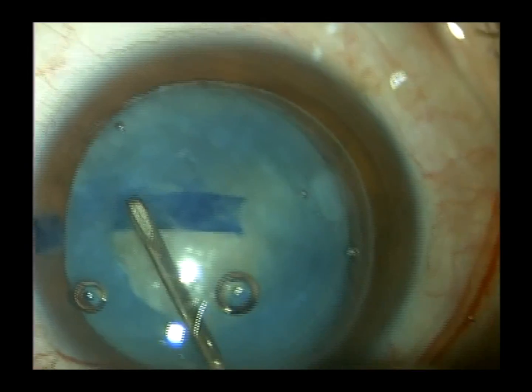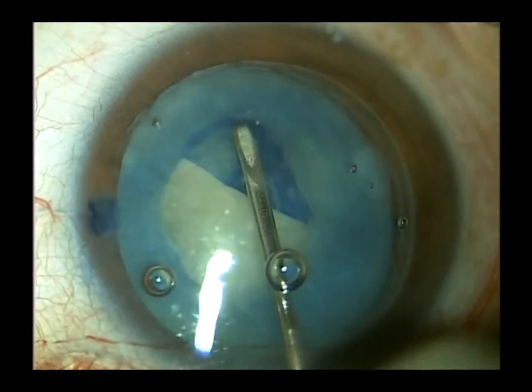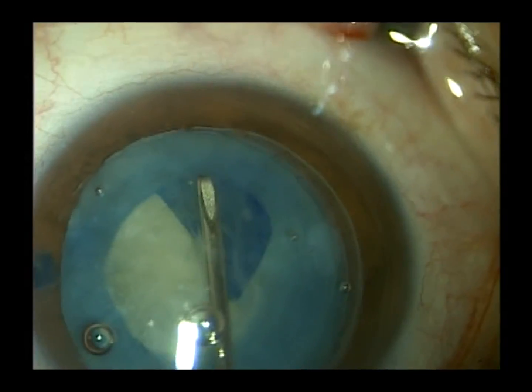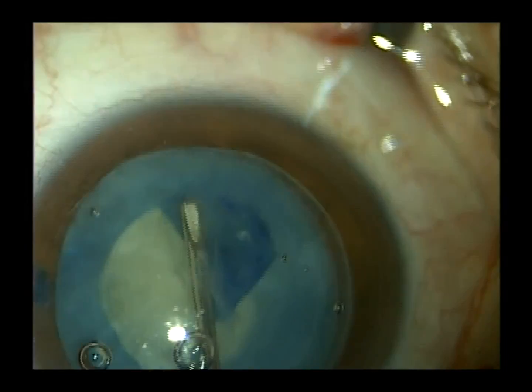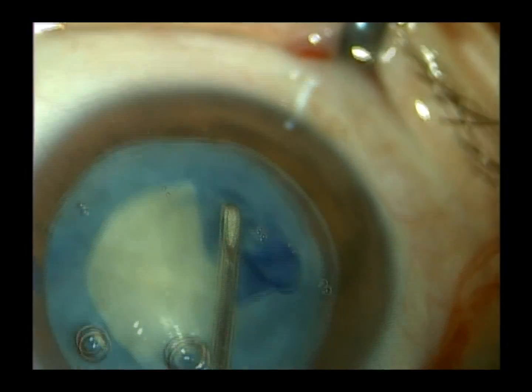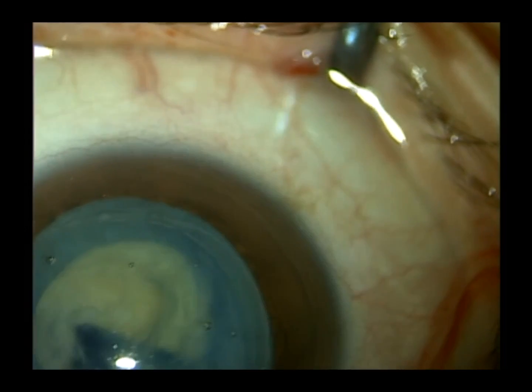I usually make my capsulorhexis openings about five to six millimeters in diameter. It's fun using Vision Blue when we need it because it makes the impossible possible. Had we not stained the capsule, doing this safely would be very difficult.